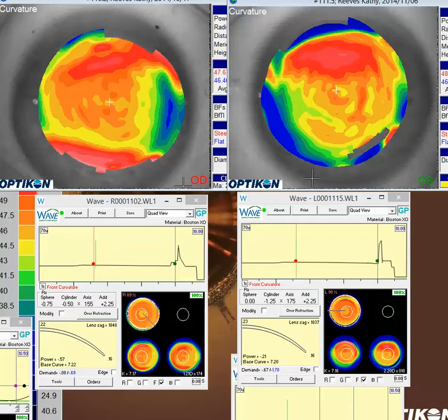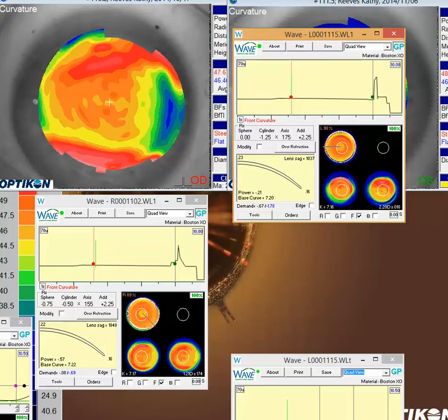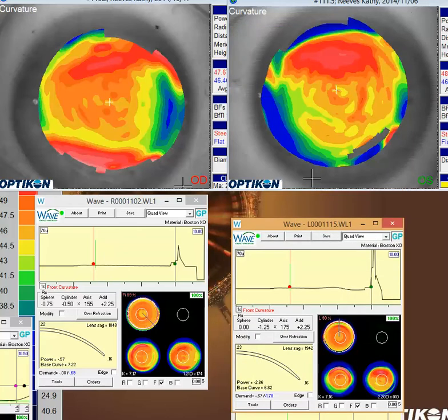And that will also probably account for your over-refraction problem on the left eye where you get that extra minus 150. The lens probably slides down and you're probably getting, if you look at the lens itself, I'll slide it up here in this front anterior zone. If it slides down, this pupil probably slides out of the visual axis, and you're actually getting the over-refraction over this add zone over here. So my guess is that's where that happens. So if we can get this lens to center better, you'll probably notice that your over-refraction changes a bit.